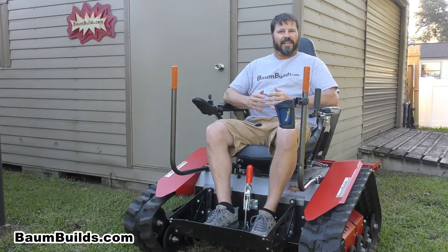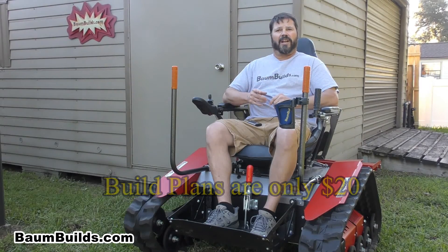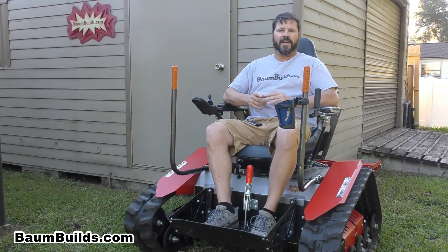The MAV is a tracked electric wheelchair that is designed specifically to help those with limited mobility get back to the outdoors. And you can build it yourself using our exclusive build plans. And even better, you can build this chair for about half the cost of commercially available track chairs.